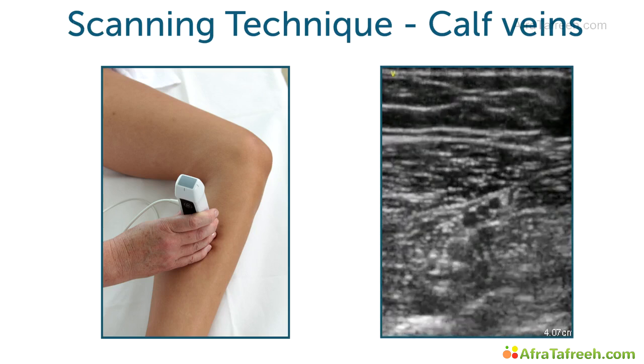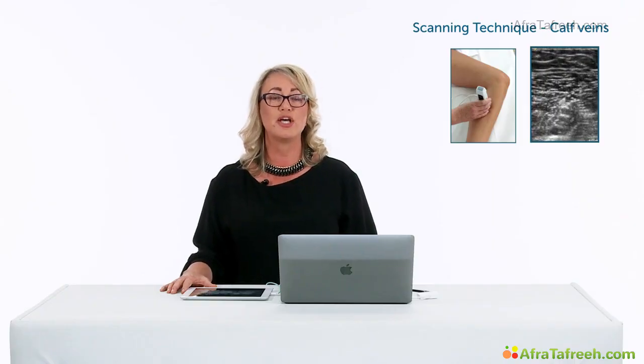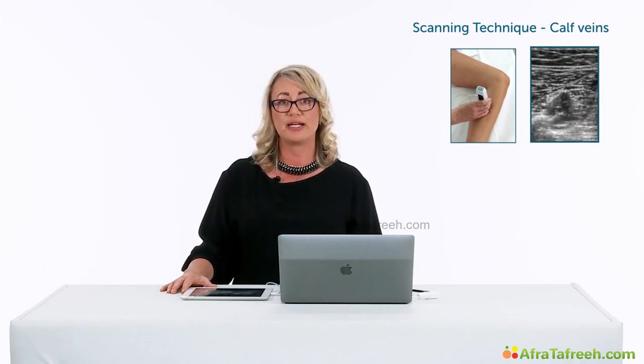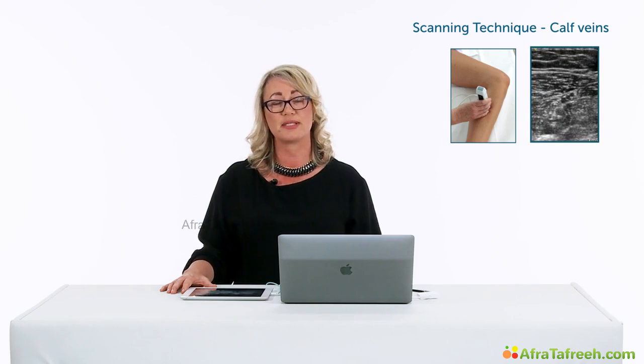and the peroneal veins are closest to the fibula and further away from the transducer. We'll slide this transducer superiorly with compressions every centimetre once again to the tibio-peroneal trunk, then slide inferiorly with compressions to the ankle. To assist with compressions, you can use the other hand to sandwich the veins between the muscles, as we did in the lower thigh.